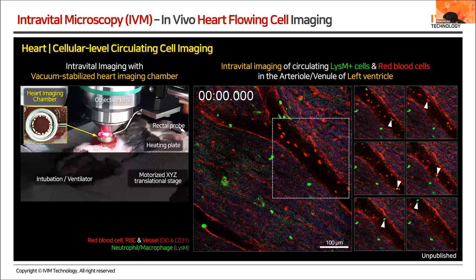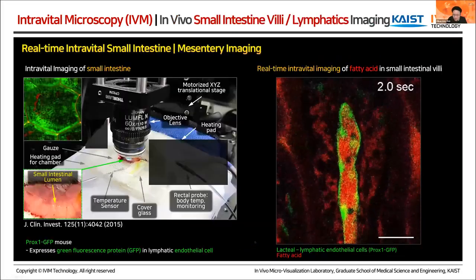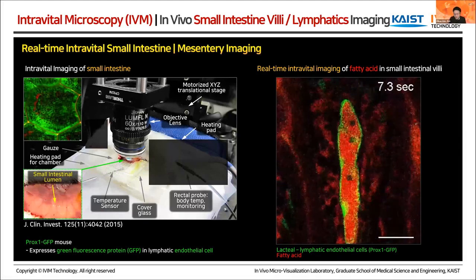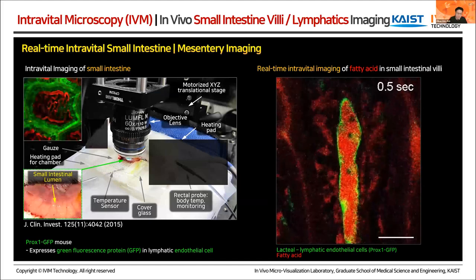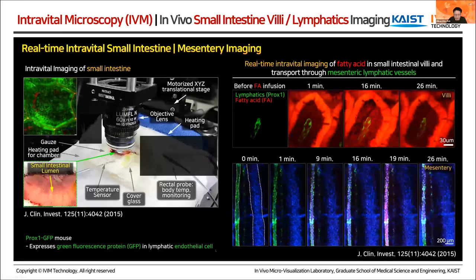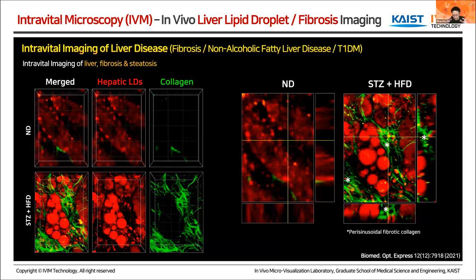So for imaging over days, how to treat the animal to get the same imaging site? Well, with the imaging window, it's relatively straightforward to find the same location. After one imaging session, we let the mouse recover, and then at a later time point, we bring the mouse back, and using our window mounting system, we locate the imaging window at exactly the same location and position under the objective lens.